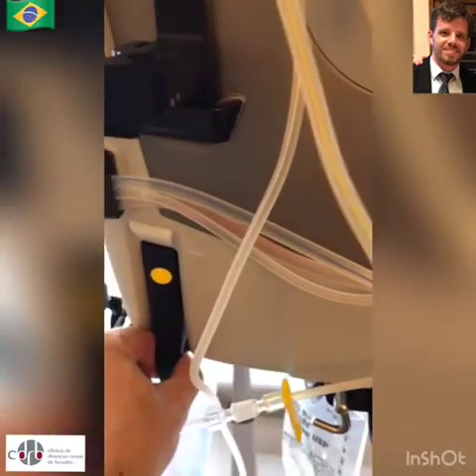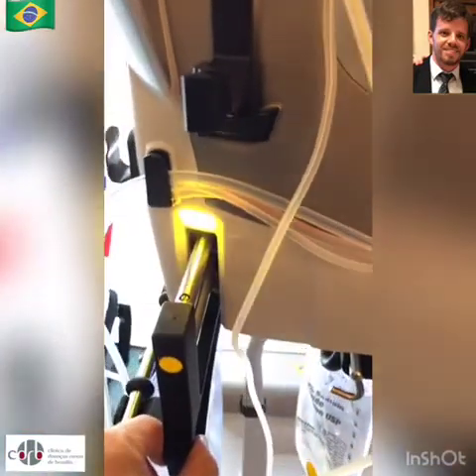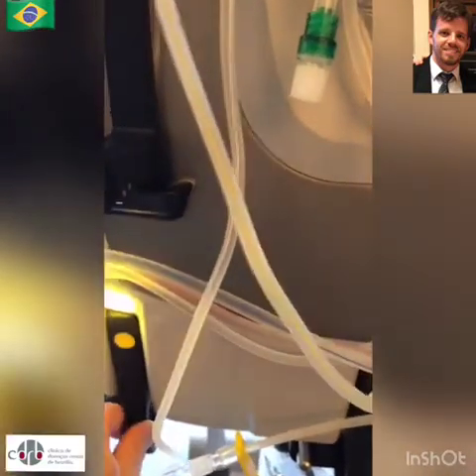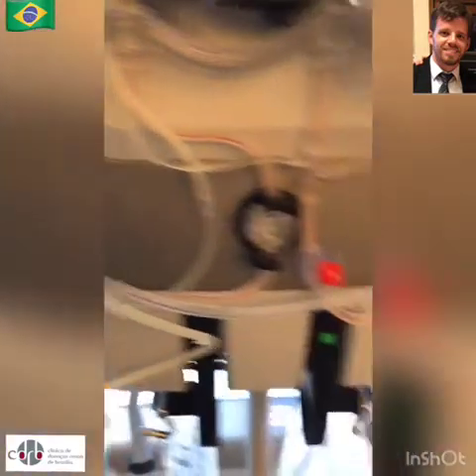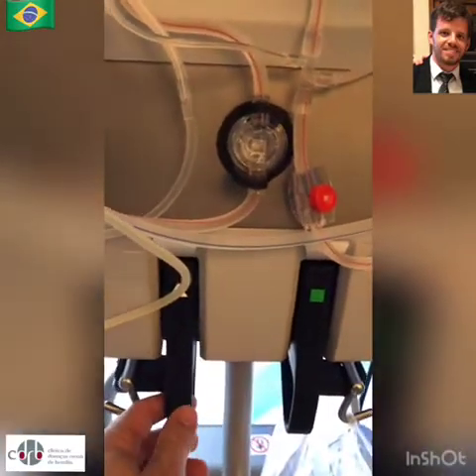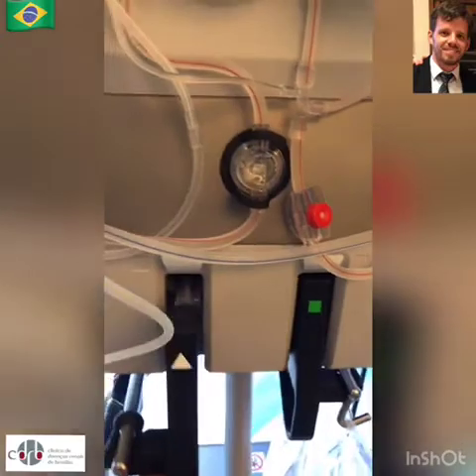When opened, a color LED twinkles. The color corresponds to the line's color: yellow for effluent, white for citrate, green for dialysate, and purple for replacement solution.